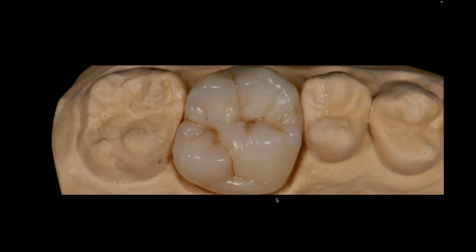And now that times are changing, not many people are building single molars anymore, although I still do. And by the way, not only do I still do it, boy, do I love when I come in and there's a molar on my desk, because it's really enjoyable. It's one of the most fun things to still build. So I still build a lot of molars, although we still do monolithic zirconias and lithium silicates and many different materials. But in the end, we still do some layering on these.